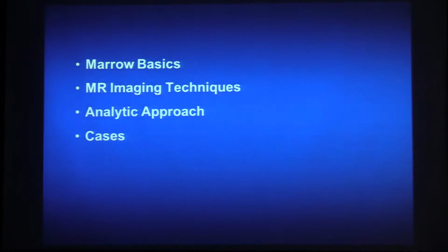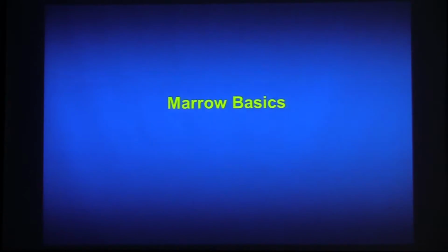So we're going to talk a little bit about marrow basics, and then we'll talk about MR imaging techniques as they relate to marrow, and we'll try to develop an analytic approach to looking at bone marrow, and if we have time we'll look at a few cases.